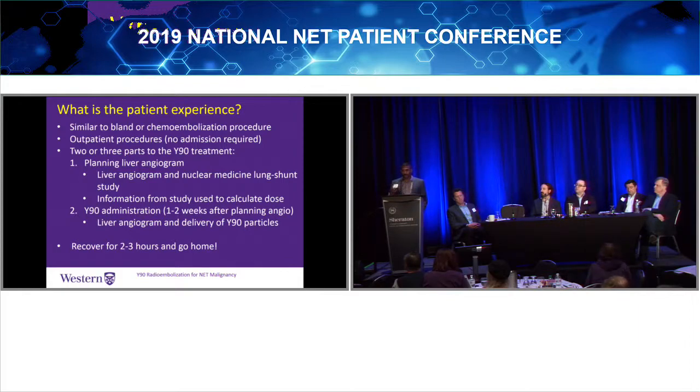And you're predicting. You really don't want any glass or any radiation spheres to end up in the gut. That's a terrible and horrible side effect or complication of the procedure. We don't see it very commonly at all. In fact, touch wood, I've never seen it in my practice, but we don't want to see it because it is very devastating. So we really have to plan and prepare.